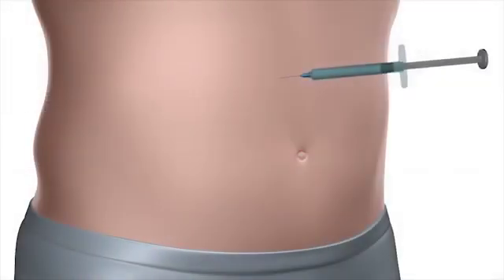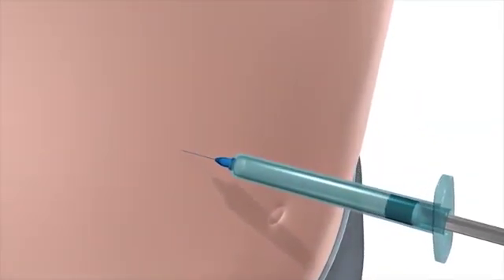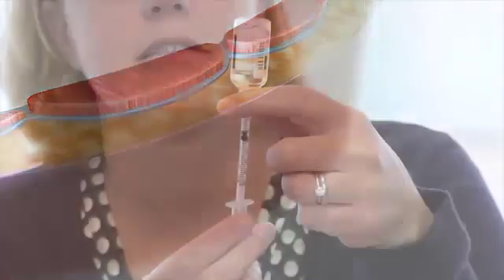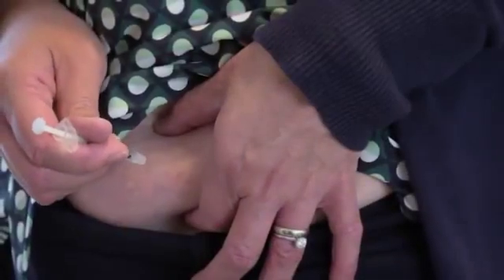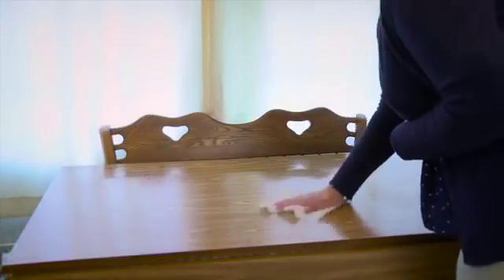An insulin injection delivers medicine into the subcutaneous tissue, which is the tissue between your skin and muscle. Subcutaneous tissue, which is also called sub-Q tissue, is found all over your body. Your healthcare provider has chosen insulin injections that are done with a syringe that is filled from a bottle of insulin as the best option for you.